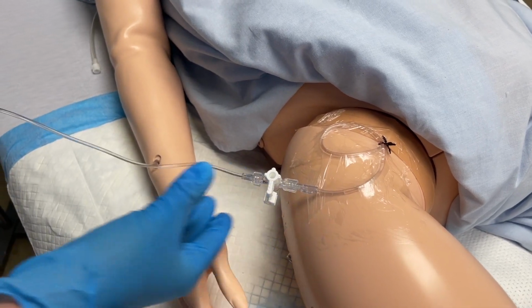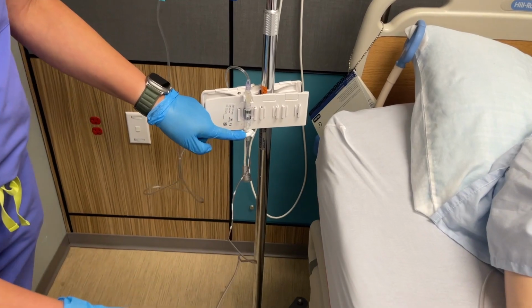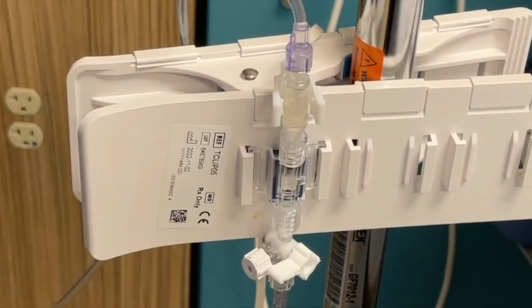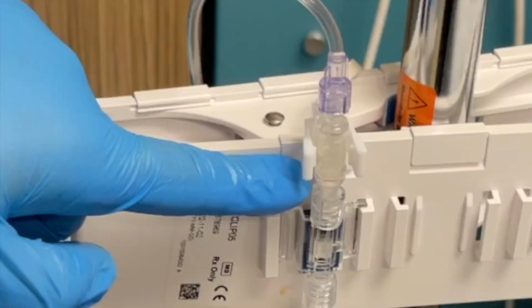Continuing to move up the setup, you will see an additional stopcock that is also a three-way stopcock just below a device that we call a transducer. The transducer has an electronic cord that resembles a phone cord. This sends signals to the patient monitor while we are monitoring the patient's vital signs. The transducer itself is what you will see clipped in this large clothespin looking item. Above that, you will see a squeeze trigger flush mechanism, which I will review soon.